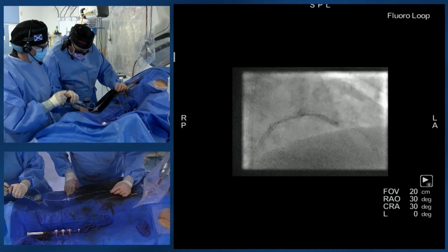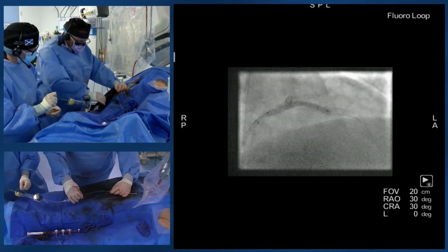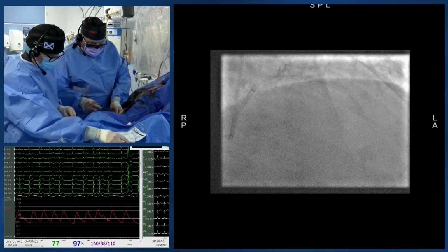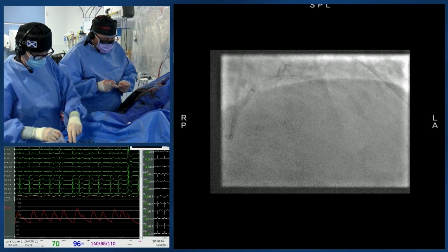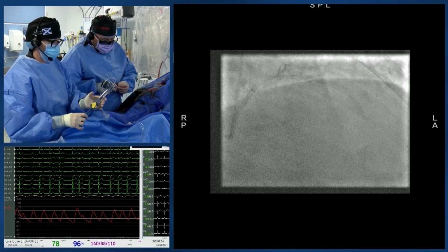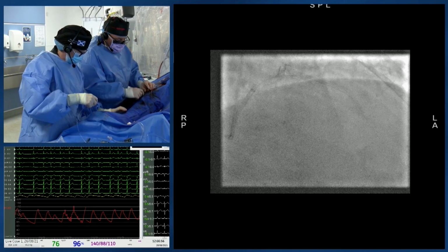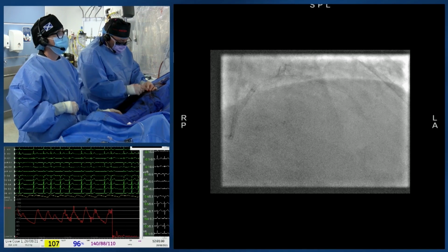Okay, so we'll take that 4.5 balloon to do a POT, and then the plan will be to rewire the circ. We're going to do the proximal optimization. Again, it's really important we do this to avoid abluminal rewiring. And when we do come to rewiring the circumflex, on this occasion we want to aim for a mid to distal cell. It's not quite so imperative that we're very distal on this occasion.